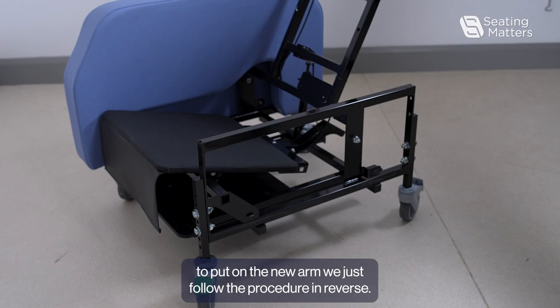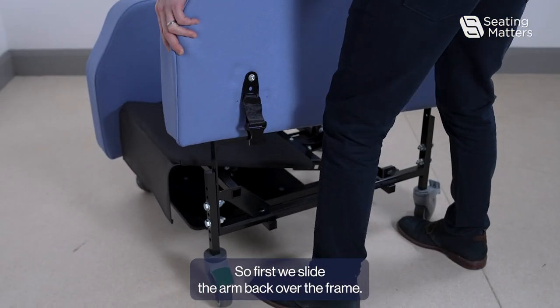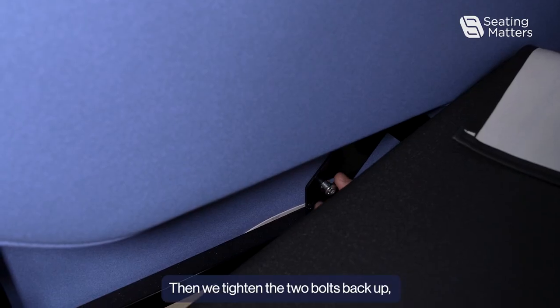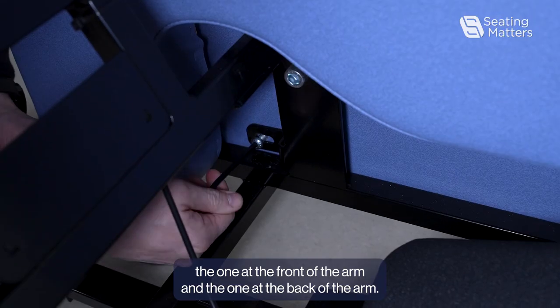To put on the new arm, we just follow the procedure in reverse. First we slide the arm back over the frame, then we tighten the two bolts back up — the one at the front of the arm and the one at the back of the arm.